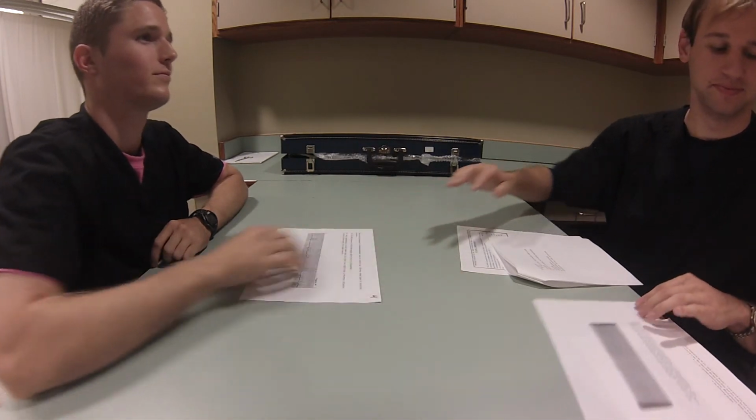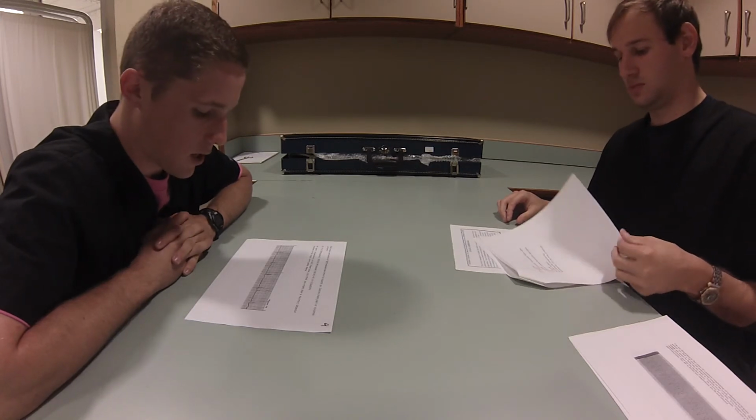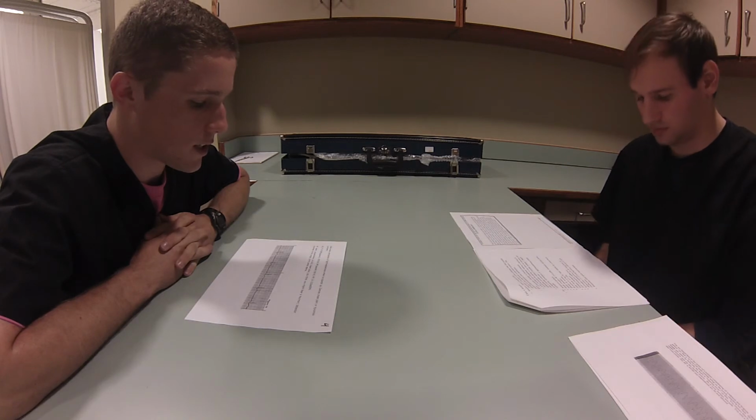Case 4. This rhythm is sinus bradycardia. You have a 69-year-old male complaining of lightheadedness when he stands up, denies chest pain or dyspnea currently. Pulse is 50, blood pressure supine is 162, blood pressure seated is 88/42, and respirations are 16, O2 saturation is 89%. Patient is alert, cooperative, no JVD, heart slow. You think you might hear a murmur, bibasilar crackles in the lungs, and 2 millimeters pedal edema.